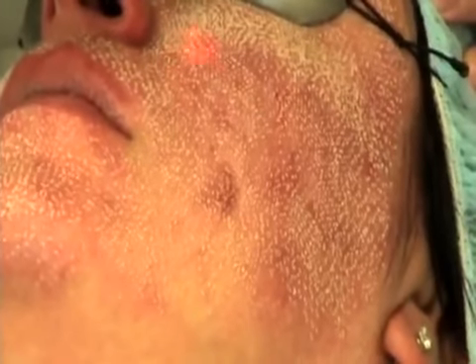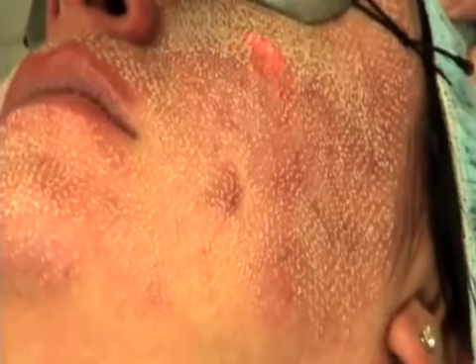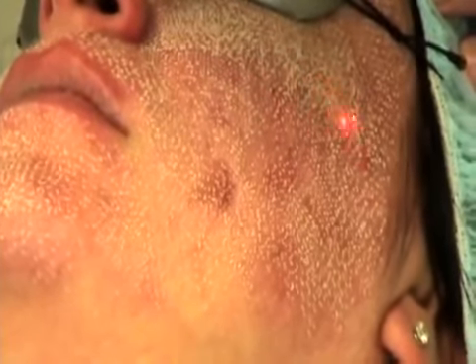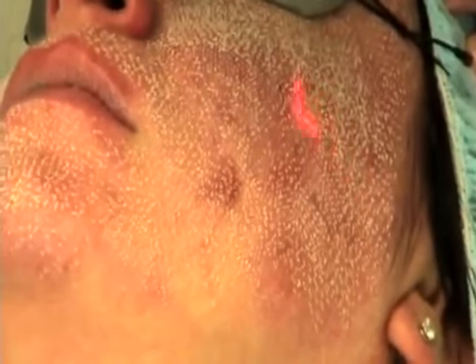After an initial pass, a second pass may be laid over the same area to increase the density or coverage of the treatment. Here, a second pass is being done over the left cheek area.